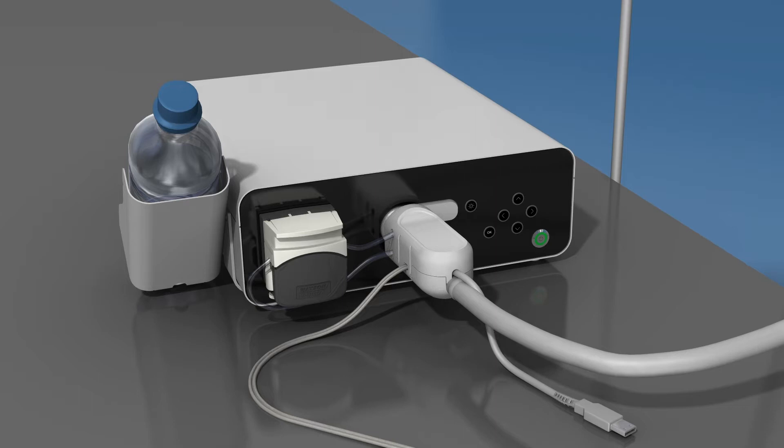The A-Box Duodino and A-Scope Duodino require one 1,000 mL bottle of sterile water for complete system operation. This water is for rinsing the distal camera lens of the endoscope, as well as to maintain normal operating temperature of the illuminating LED lights. The water must be changed prior to the beginning of each case. Place a 1,000 mL bottle of sterile water into the bottle holder on the left side of the A-Box Duodino.